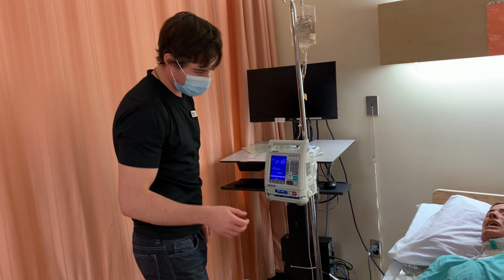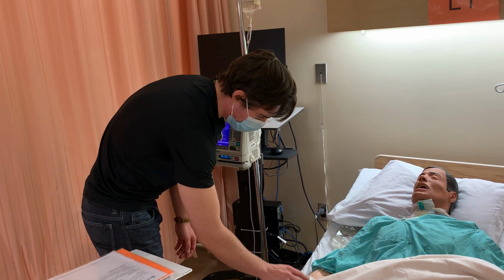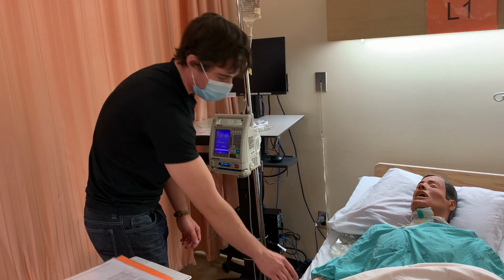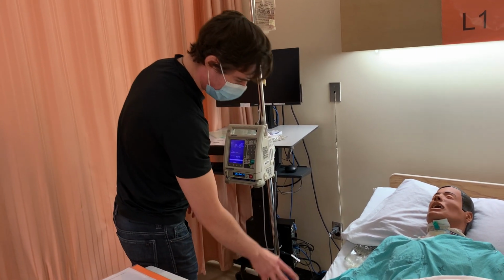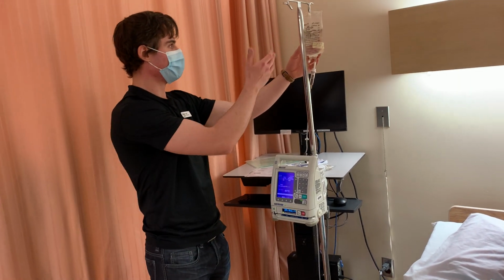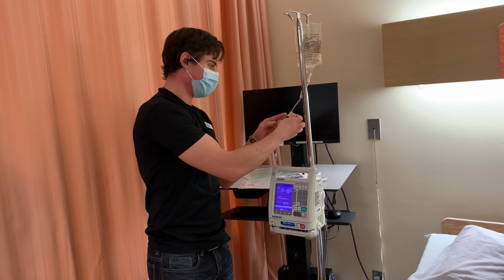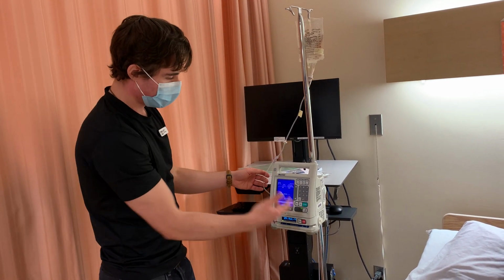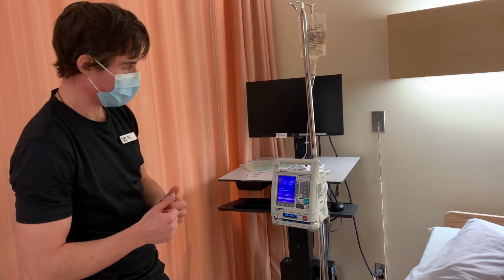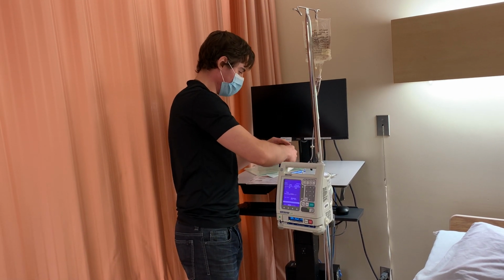So next, I'm going to check the IV site here. I'm going to palpate around the site here. Do you have any pain? She says no pain. I'm going to assess for any phlebitis or infiltration or redness. That's all good. And then I'm going to assess our bag here. So it is a normal saline, which is compatible with our medication. The line is not expired, and all the clamps are open, and it is infusing at the appropriate rate stated in the physician's order.